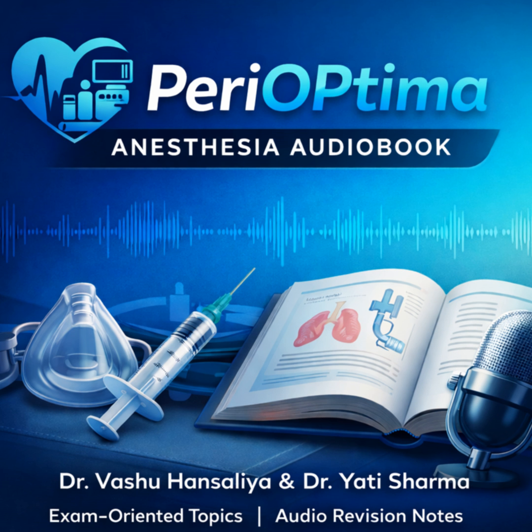First up, a standard post-op patient who just had their gallbladder out. Healthy lungs. Keep it simple. Start them on VCV or volume AC. You want guaranteed minute ventilation while they're still groggy from anesthesia. Once they're awake and breathing well, you can switch to PSV for a short while, or just put them on a T-piece to see if they're ready for extubation.